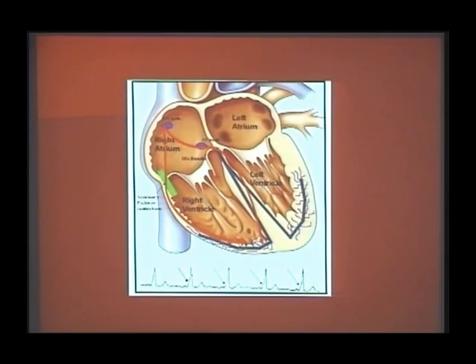Because this portion of the depolarization process is reaching the ventricle very fast, your PR interval is short. After this, once it has come to the ventricle, it is getting conducted very slowly because it is going to go through the muscle. That initial portion tells you the activation front which is coming through the accessory bundle. By the time it is slowly spreading, the impulse which is conducted through the normal system, after getting delayed at the AV node, gets rapidly conducted through the specialized conduction system that produces the terminal sharp portion, the normal portion of the QRS which is coming through the normal conduction system.